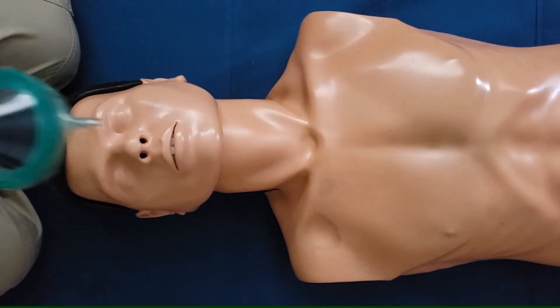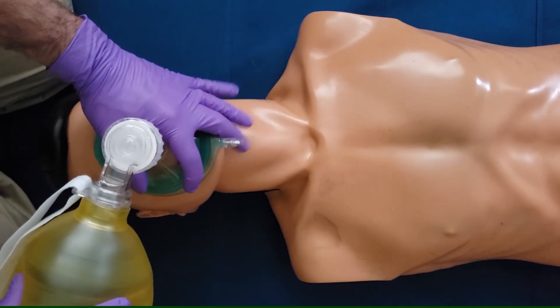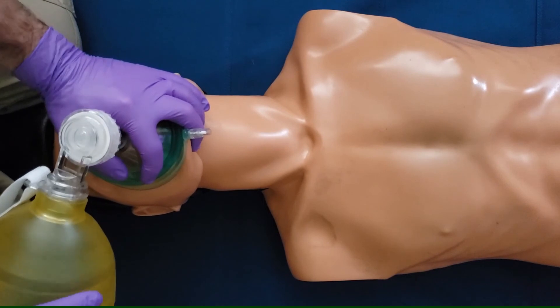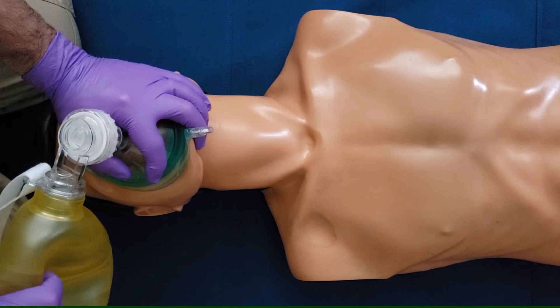Place the mask properly on the patient's face, put your thumb up high on the mask, tips of your three fingers on the bony part of the jaw, head tilt chin lift, lean over the bridge of the nose, and gently squeeze the bag until you see chest rise.